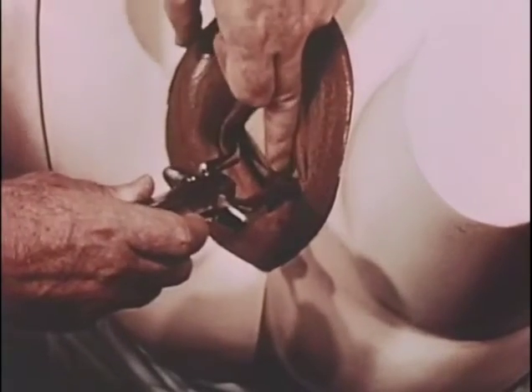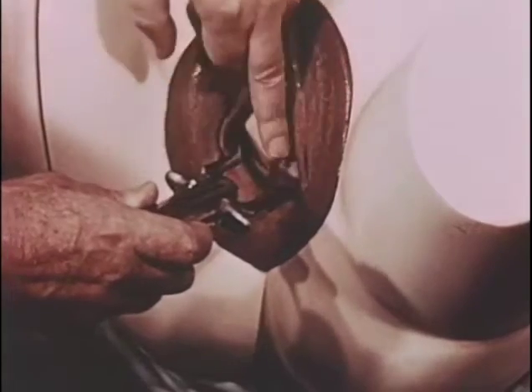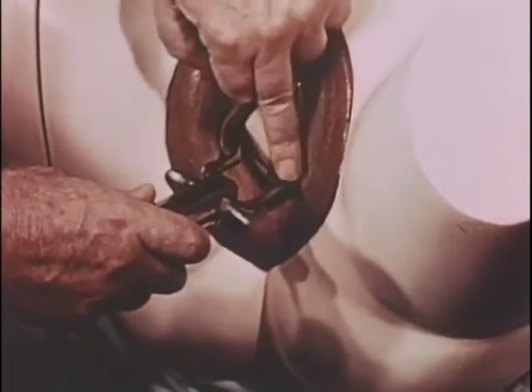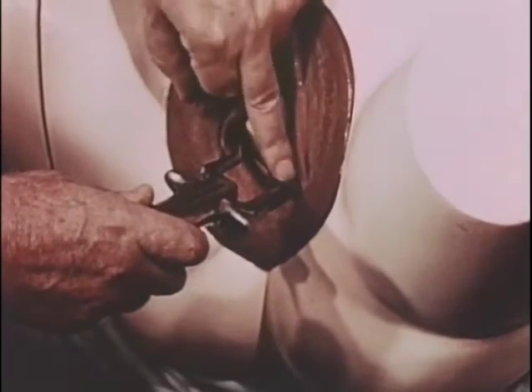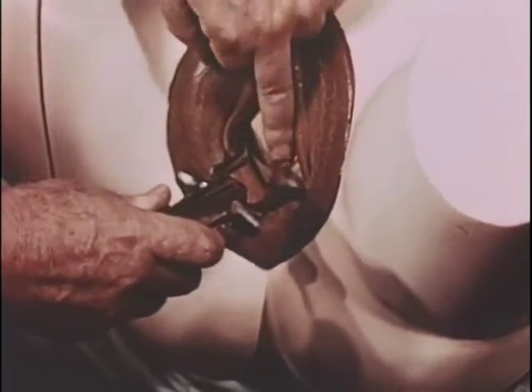If the sagittal suture should curve off to one side or the other as it passes below the plane of the shanks, it suggests a faulty application, the brow mastoid application, which should be corrected.